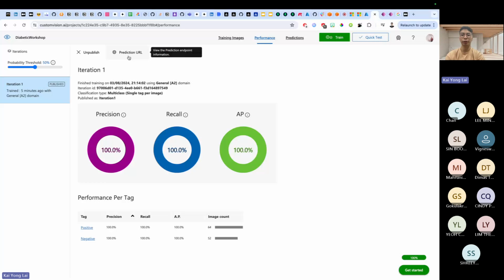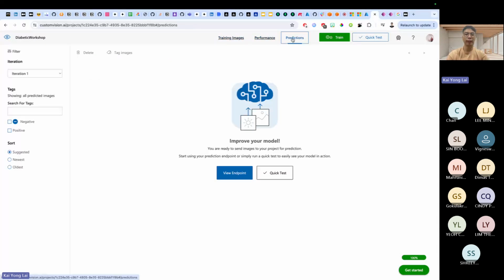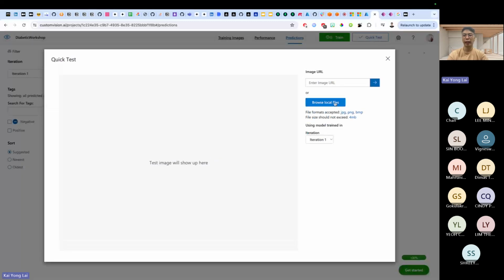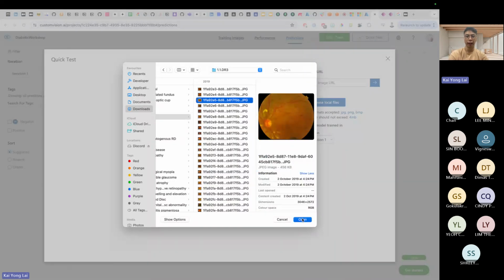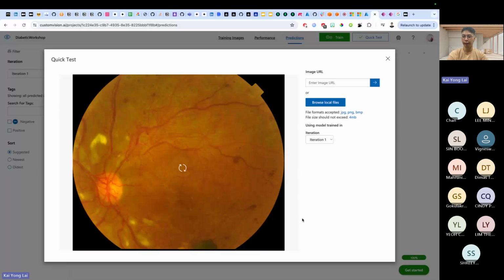Of course, before we head into the development, you can click on predictions. This is where you can test your data. So we go with quick test and browse local files. Since we haven't used the DR3 files, we can place one of the images. I hope it works correctly here.